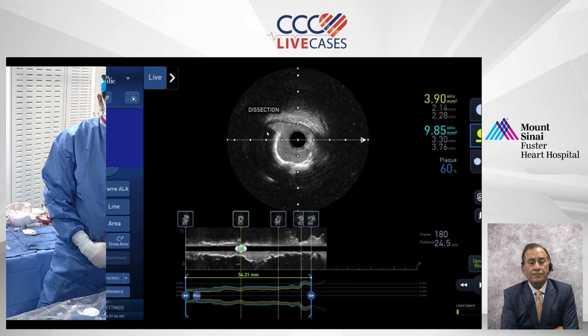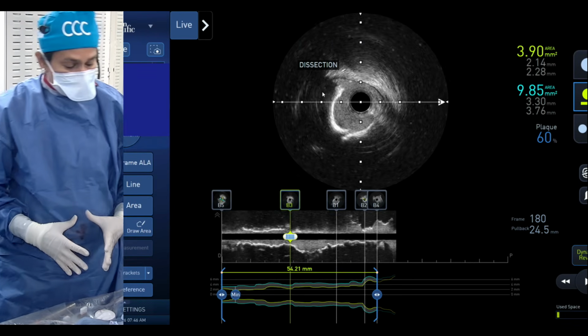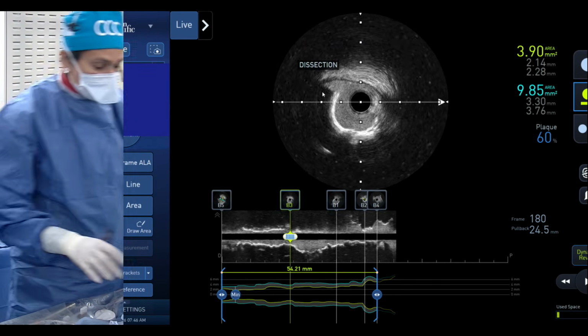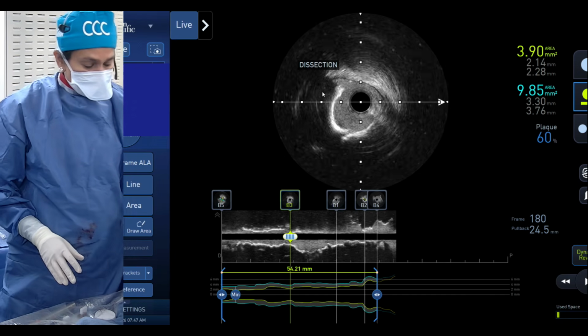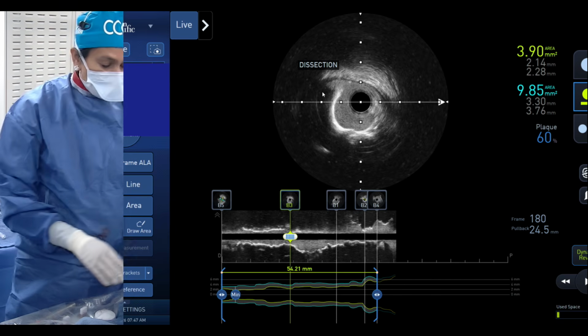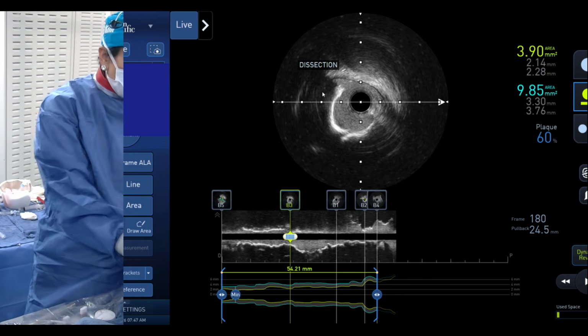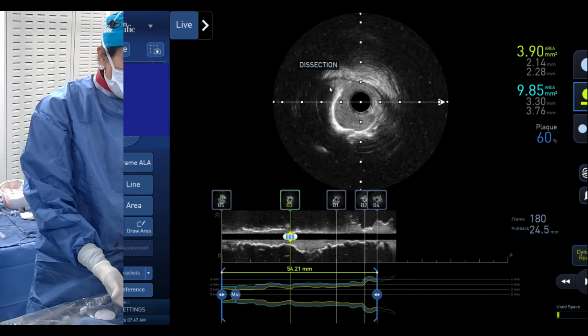Yep. So one point that we want to make, I don't know whether we have enough cases to come out with this algorithm, which we always try to say, which one you should use: either a kind of atherectomy device you have used, then you say, okay, do I use cutting balloon, do I use IVL, and if you are using IVL, what size IVL?